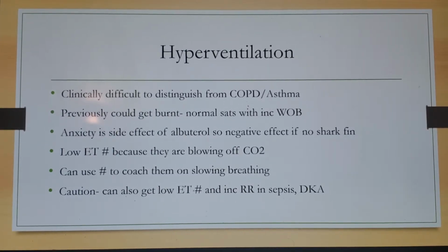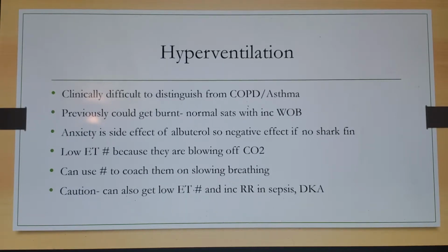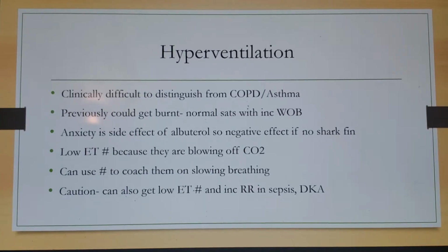Hyperventilation is difficult to distinguish from COPD or asthma. You could previously get burnt. If you've got a patient with increased work of breathing but normal sats, you might say, oh, they're just anxious and hyperventilating. Well, just remember, anxiety is also a side effect of albuterol. So it could have a negative effect if you keep giving duonebs to somebody with anxiety with a box-shaped waveform.